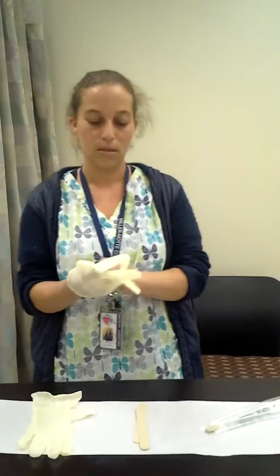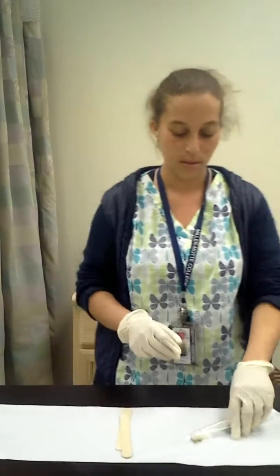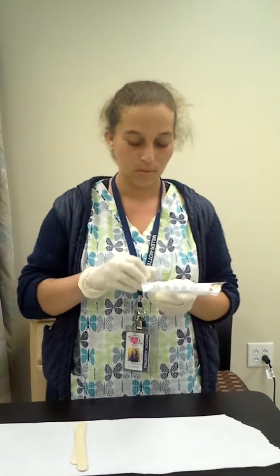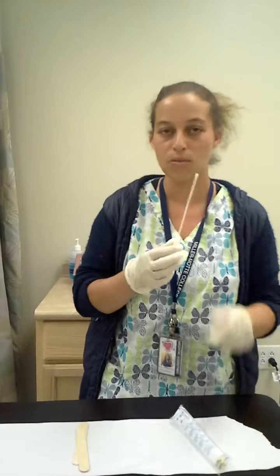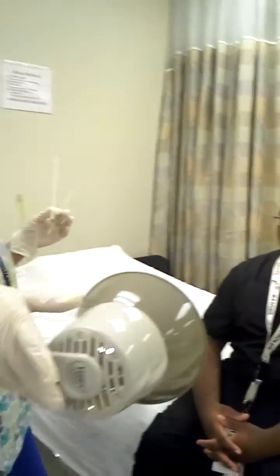I'll be right back, I'm going to wash my hands. Alright, now I'm ready to go. Have a cotton swab applicator as well as your tongue depressor. Make sure you have a light source so you can see down your patient's throat.